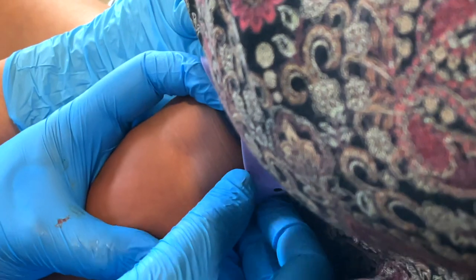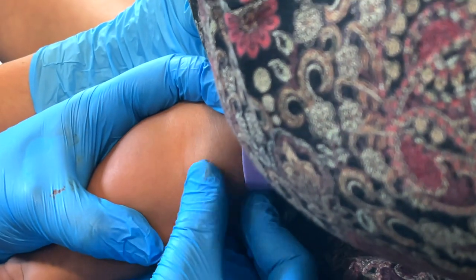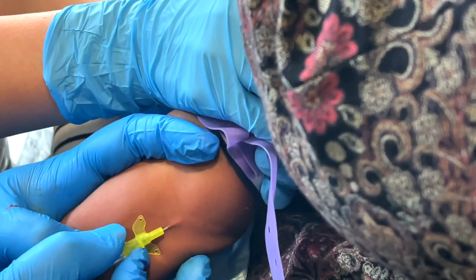Remember there are other options in the hand as well, but if you're choosing one that looks really spindly, even if you get it in and get that flashback, it can be really tricky to feed it through. If you're going for the forearm and can't see anything, using an ultrasound can be really helpful to find the vein and get it in first time.